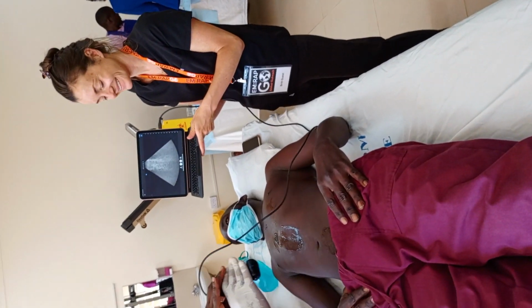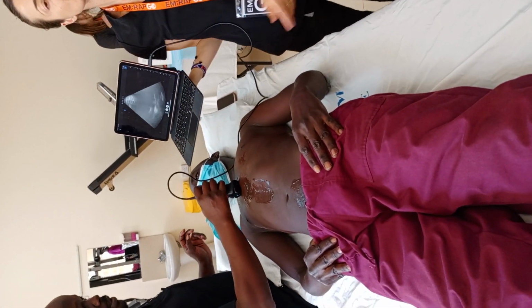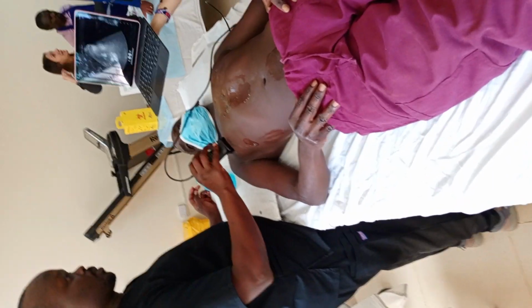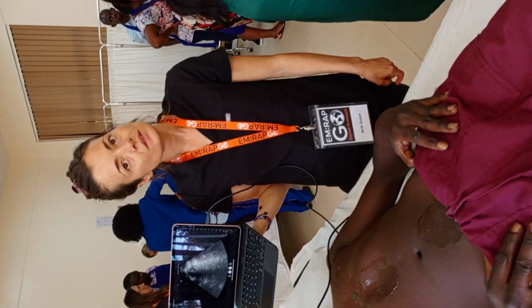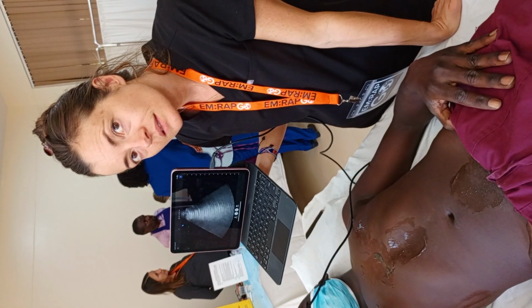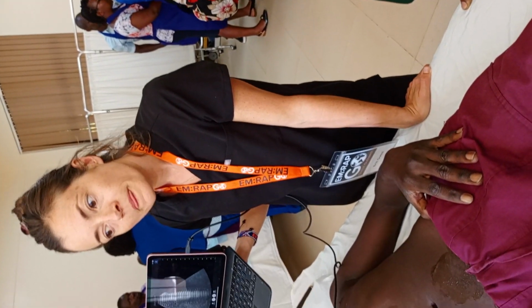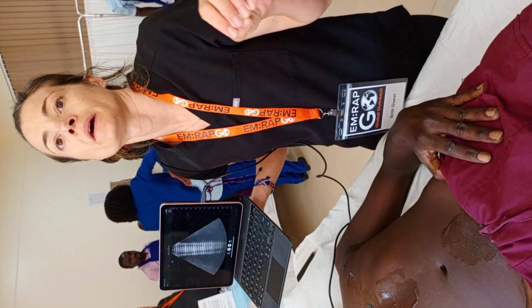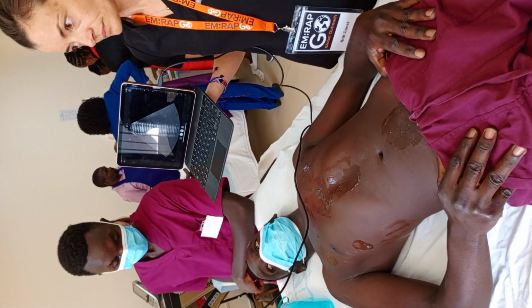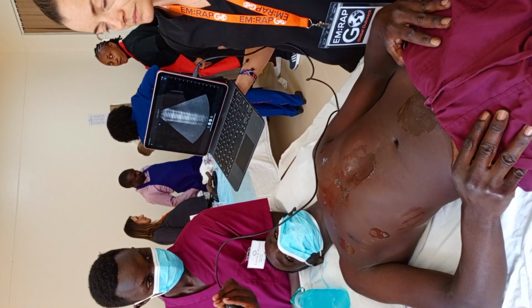All right. Okay. Question. In a trauma setting, is this designed for the trauma setting, or you're doing a POCUS? When I'm doing FAST, yes. When you are quantifying the fluid, do you quantify as massive or just say it's positive whenever there is blood? So you're asking, do I say positive or do I quantify it? Usually we don't quantify. For internal bleed, it's either positive FAST or negative.